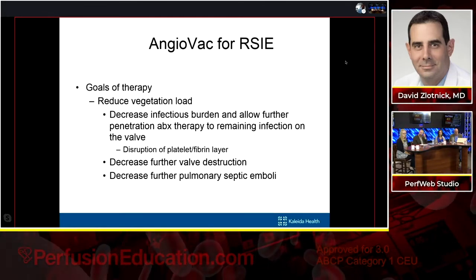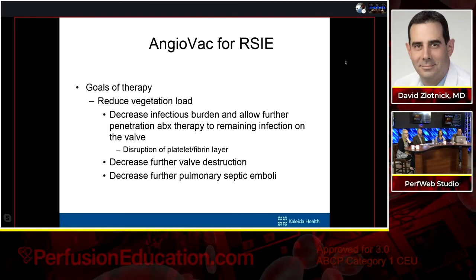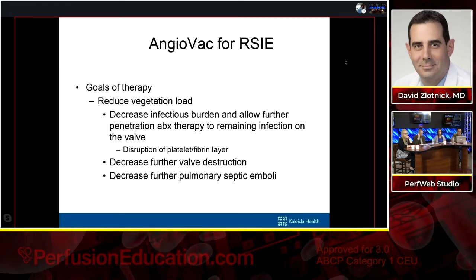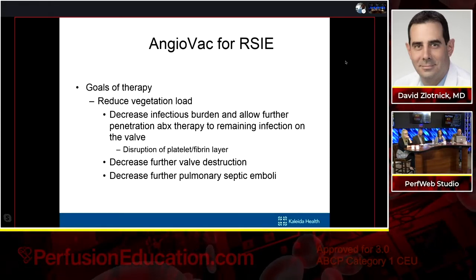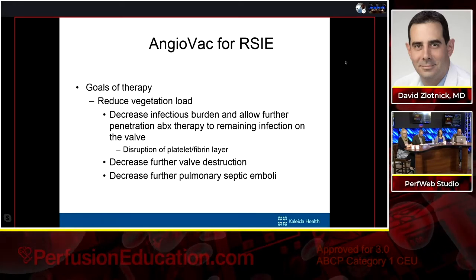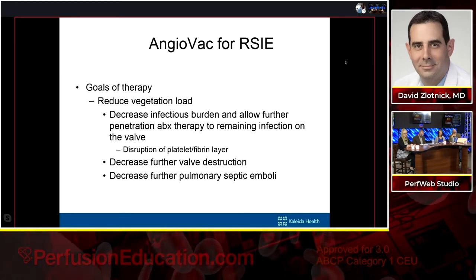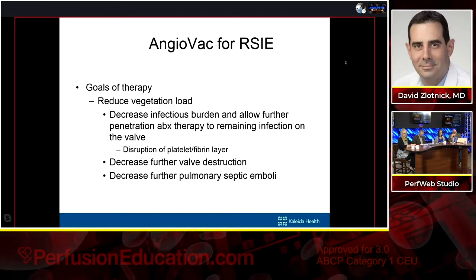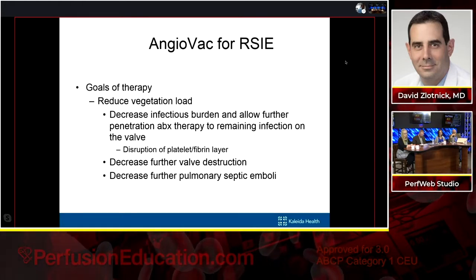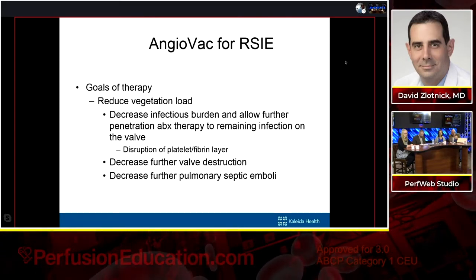By getting in there and doing that, we also want to decrease further valve destruction as well as decrease risk of further septic pulmonary emboli. So the way I like to talk to my colleagues about it is that what we're doing with AngioVac is we're really trying to take a patient who may have been surgical, do a procedure, and then continue to treat them medically. So this doesn't replace the need for antibiotics or replace the duration of antibiotic therapy, but is actually an adjunct to medical therapy with antibiotics. And ideally, what we'd like to do is be able to recover these patients, and then if, again, they're not using, they stop doing the high-risk activities that got them involved in the first place, and they start having morbidity from right heart failure from severe TR, then 6, 12, 24 months later, that's when we think about bringing them back and doing a tricuspid valve repair or replacement.